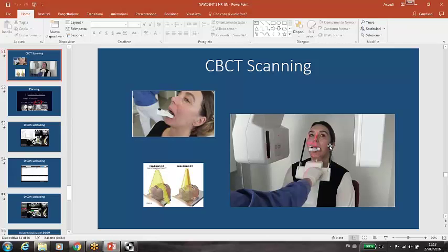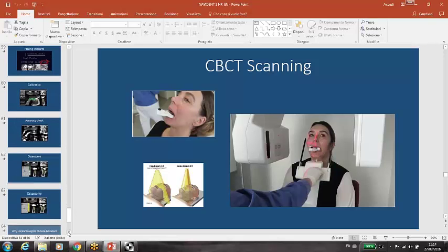Okay. Luca, we have one more question. On a case here in Istanbul, we tried to do a case, I think we were working on a mandibular, right? Yes. And we manufactured the Navi stent and everything. We got the CBCT, the planning was done. And during the implementation of the implant, the doctor said that when he tried to get into the bone, the screen was upside down. It was showing like it was a maxilla instead of mandibula. Why would it do something like that? I will explain exactly the reason why.